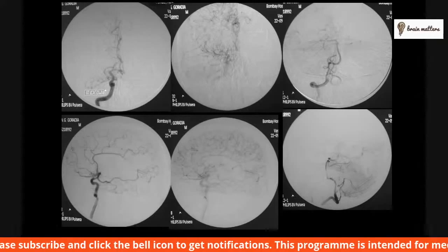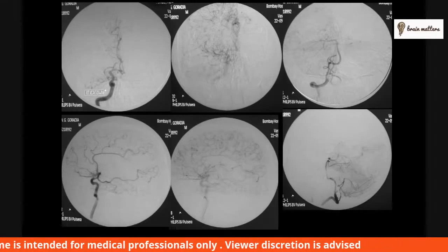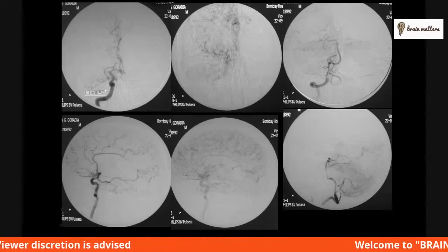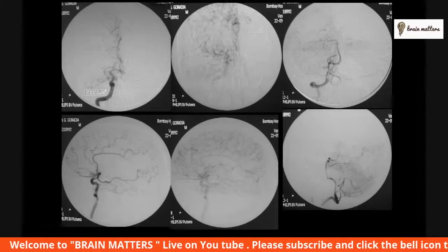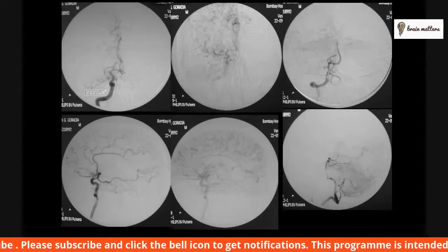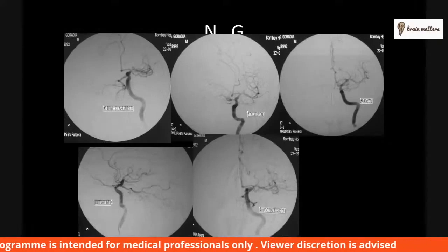The PCA, posterior cerebral artery, is large. So there is some collateral from the posterior cerebral artery. On vertebral artery injection, the PCA fills poorly, and probably the left P1 is thin, the right P1 is thin. So there is very little contribution from the basilar. So the right MCA territory is obviously completely reconstituted by collaterals from the ACA and PCA.